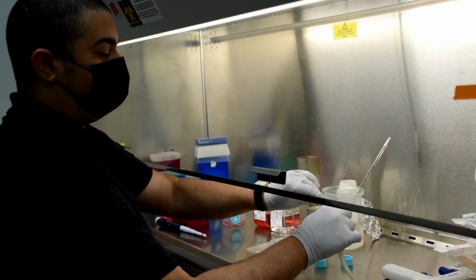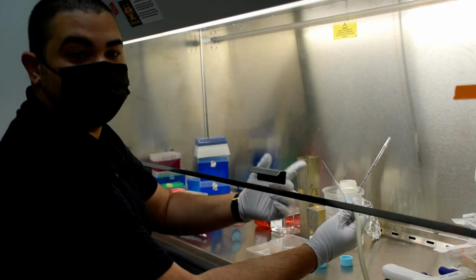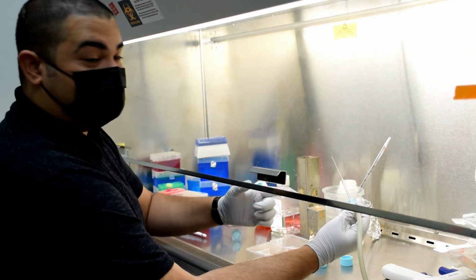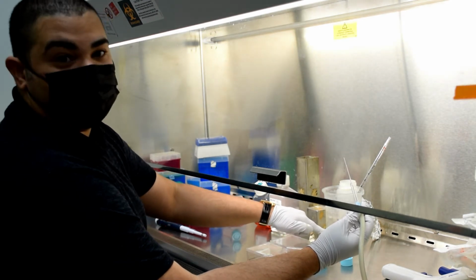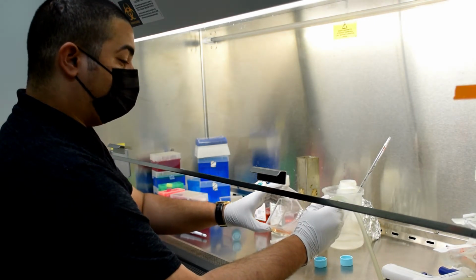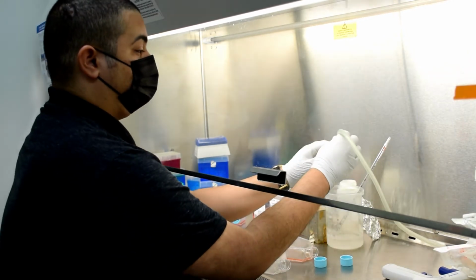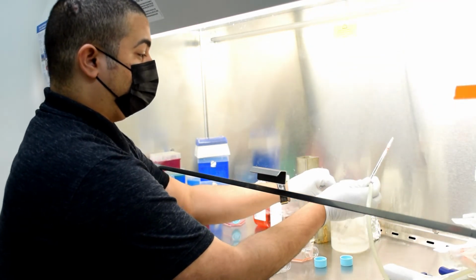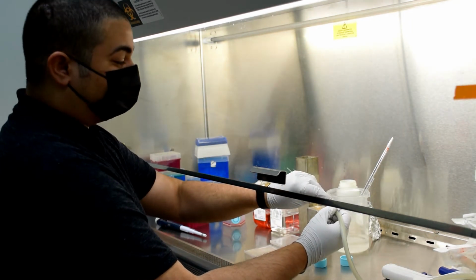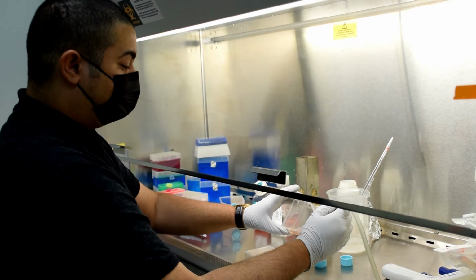So every time you're working with different flasks of cells, to make sure that there's no contamination, you want to make sure the tip of the pipette doesn't touch anything. If it does, it has to be thrown away here. This is just a mixture of water and bleach. So we can get started. We're going to pull in to the bottom, aspirate off the old media, waiting for it to aspirate off completely, and then gently, making sure it doesn't spill, put in the pipette there, and you're going to repeat the same thing with the additional flask. Same thing, aspirate off the media.